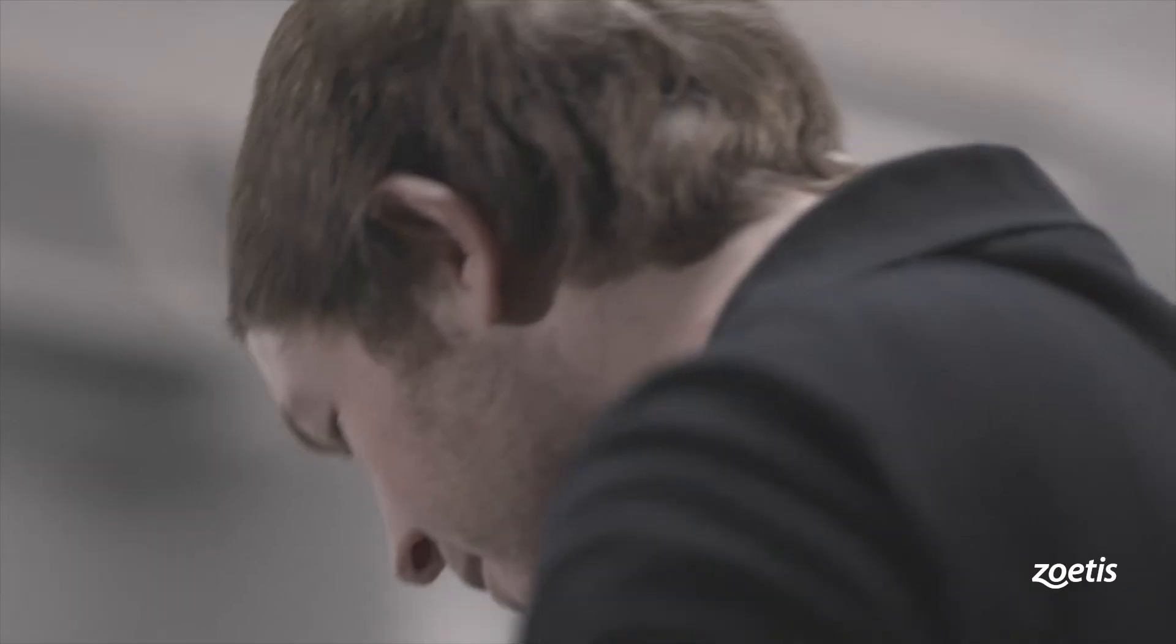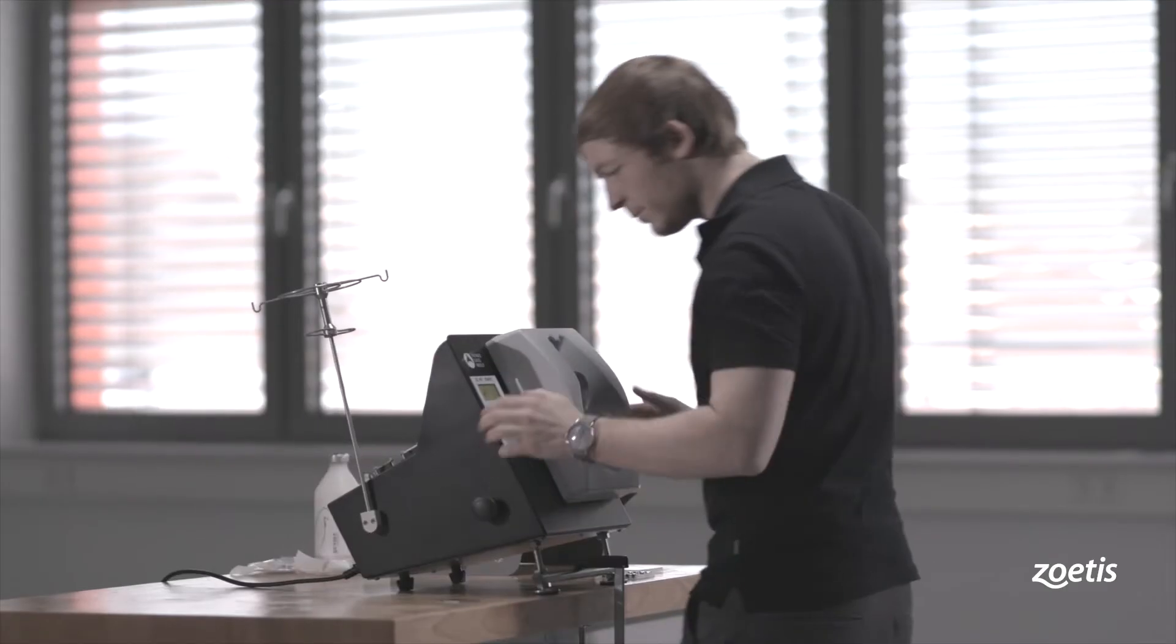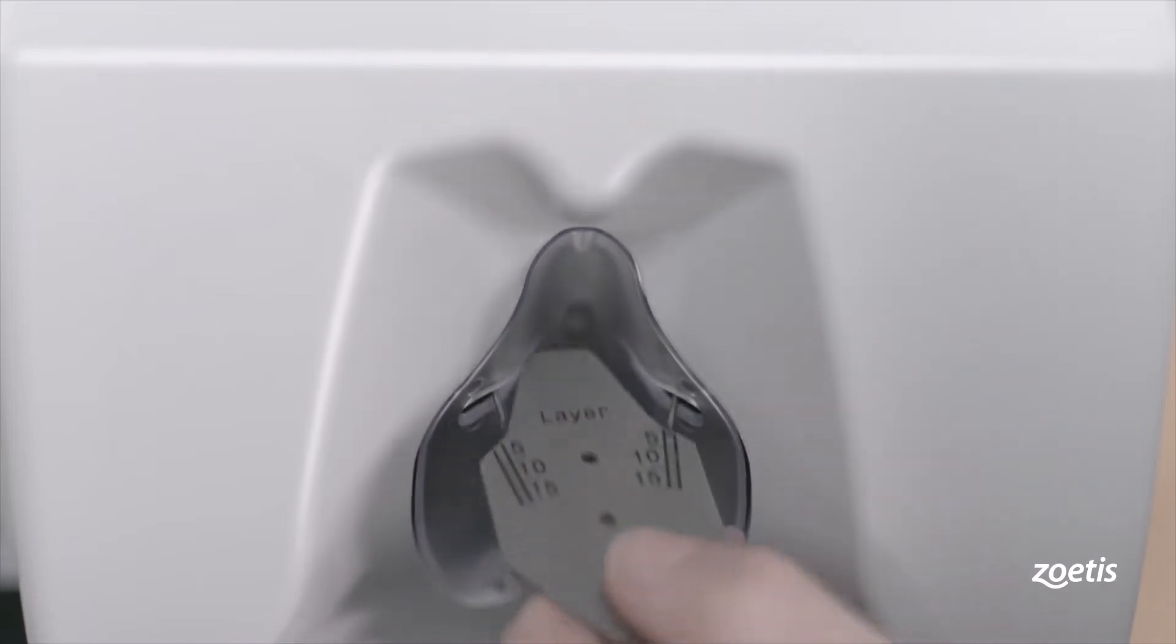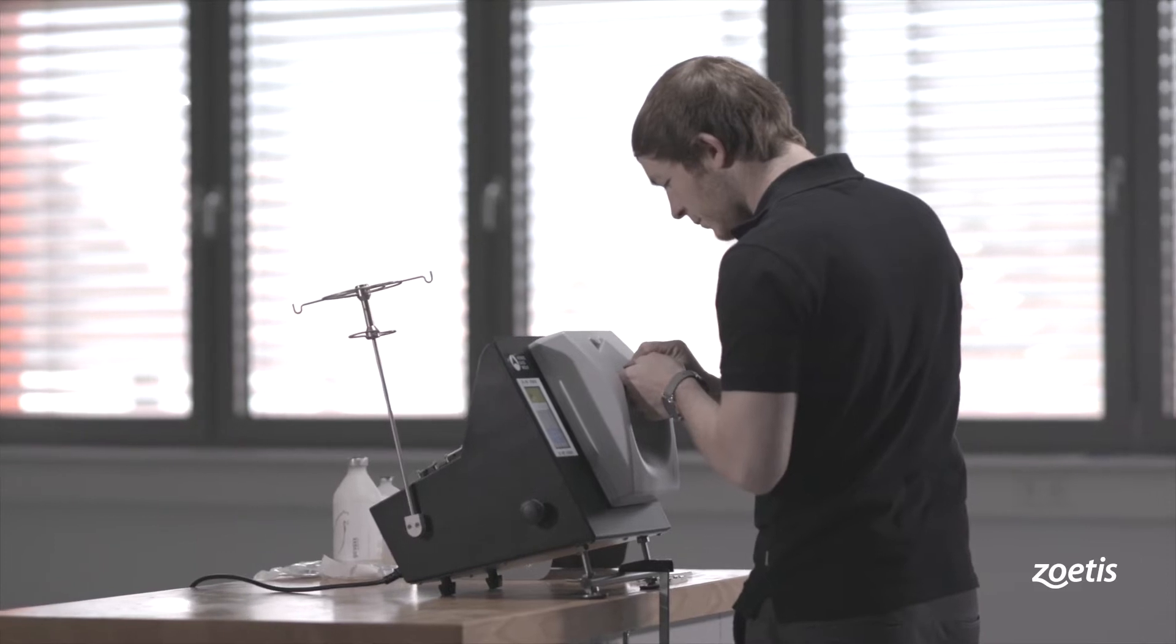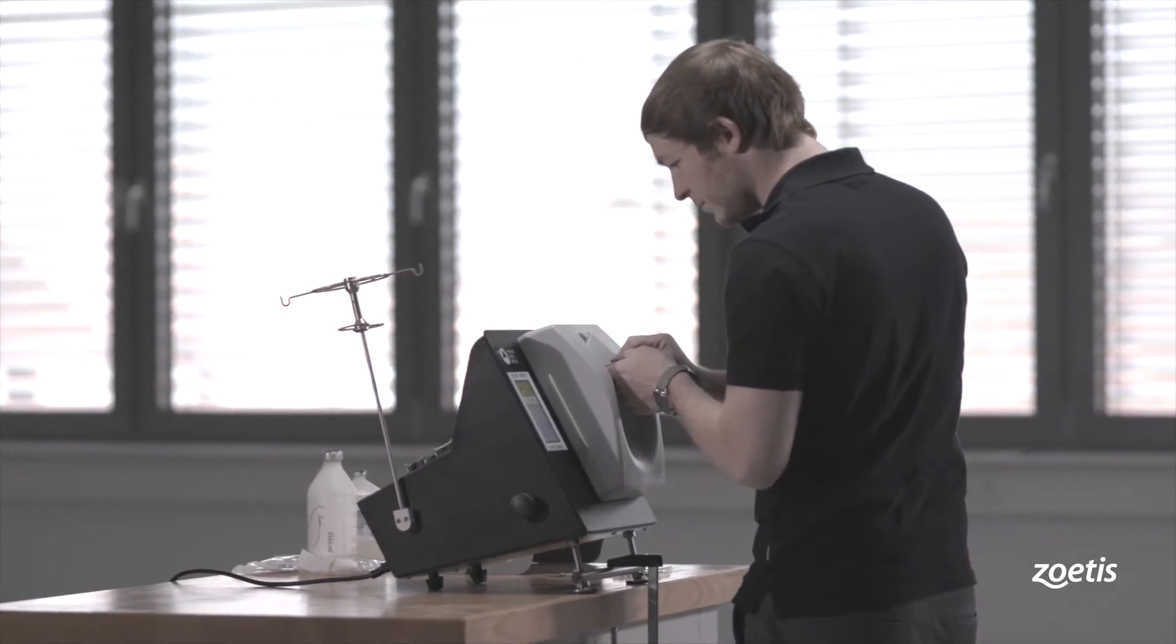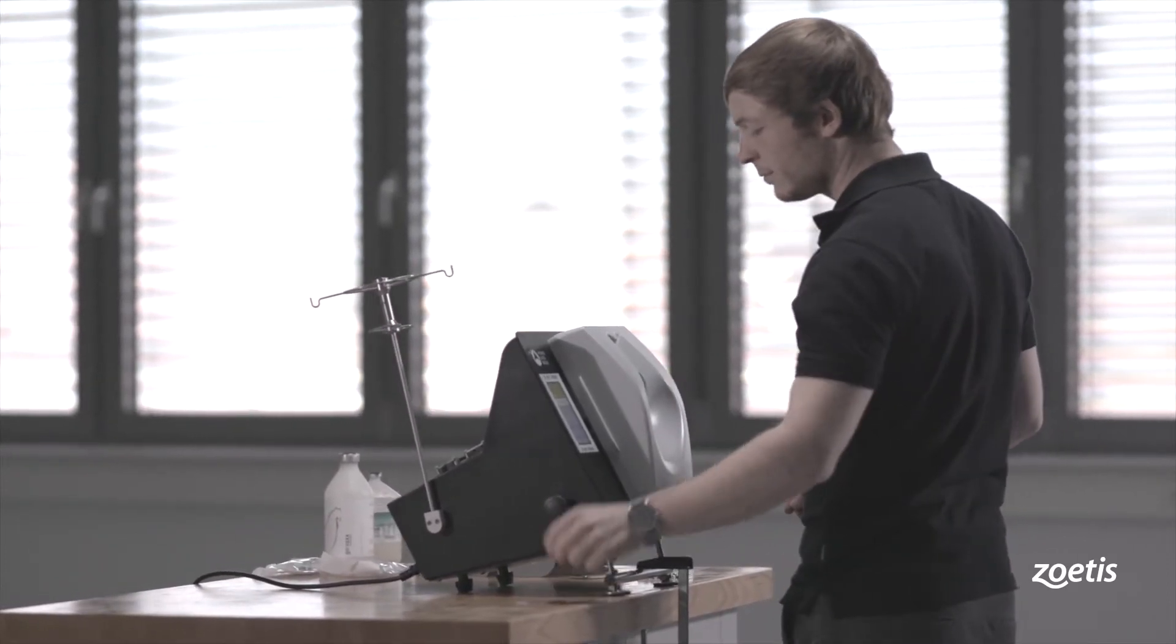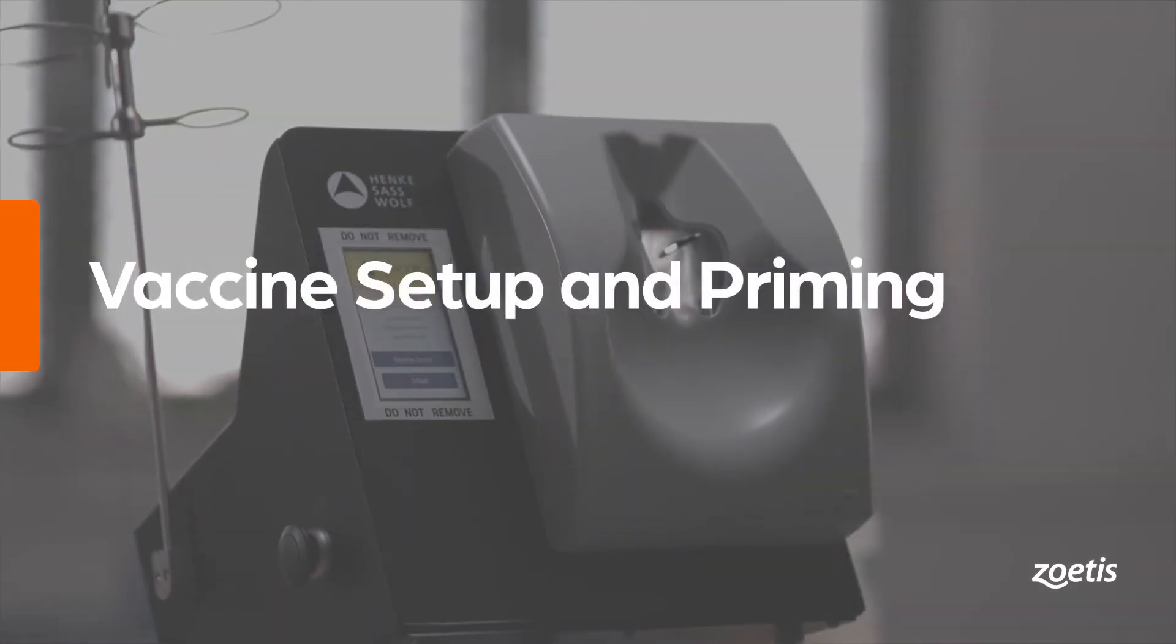Reattach a breastplate and touch Needle Service on screen again before pressing the manual button. Use the adjustment tool again to measure if the adjustments are correct. If the adjustments are not correct, touch Needle Home and repeat all previous steps. If adjustments are correct, touch Done to return the setup screen.